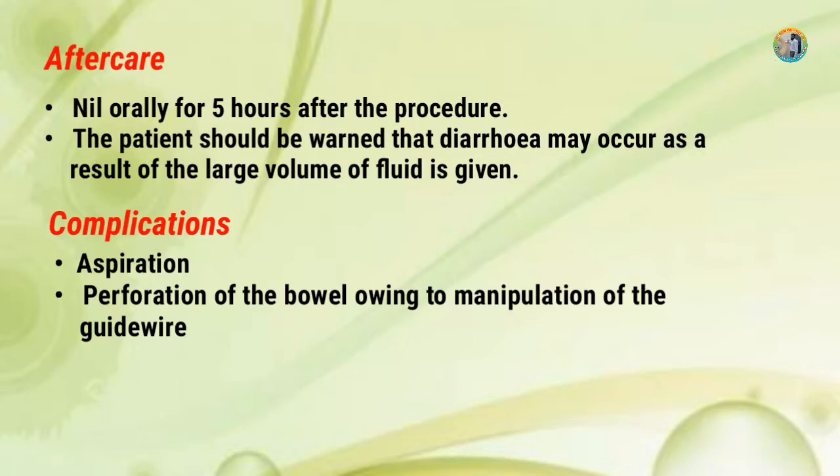The patient should be warned that diarrhea may occur as a result of the large volume of fluid given. Complications: aspiration, and perforation of the bowel owing to manipulation of the guide wire.